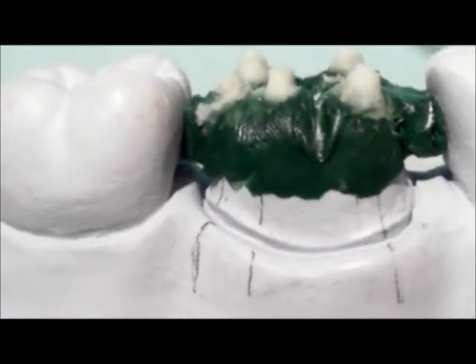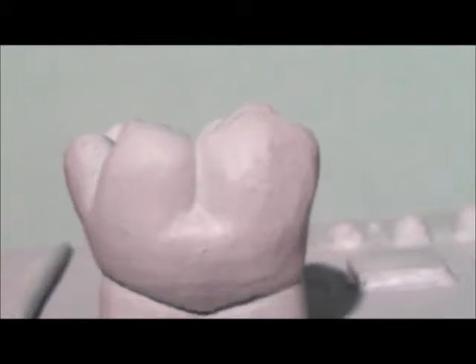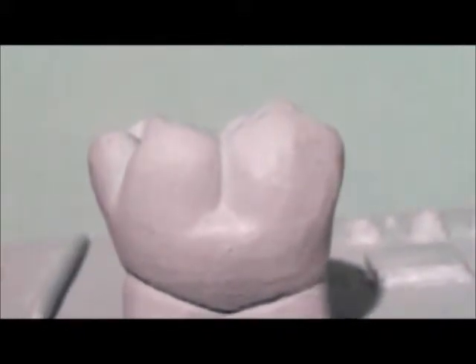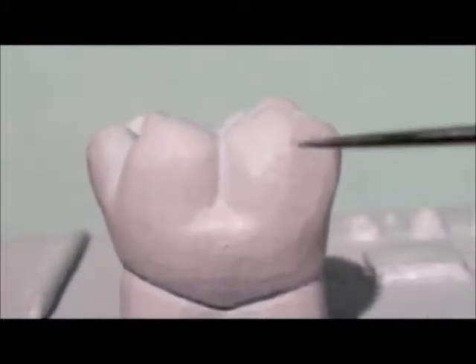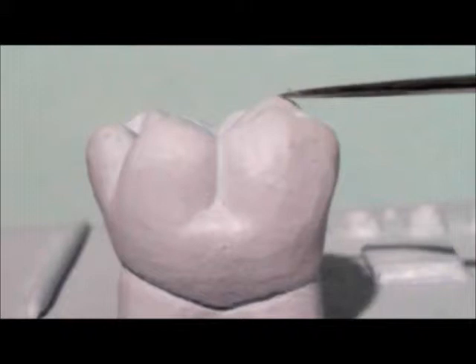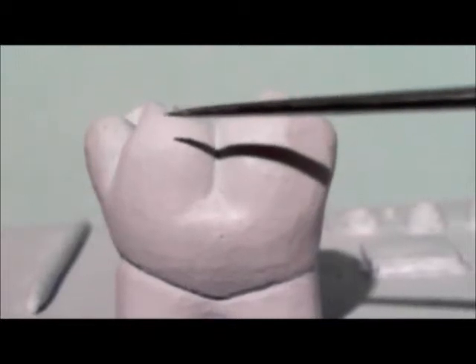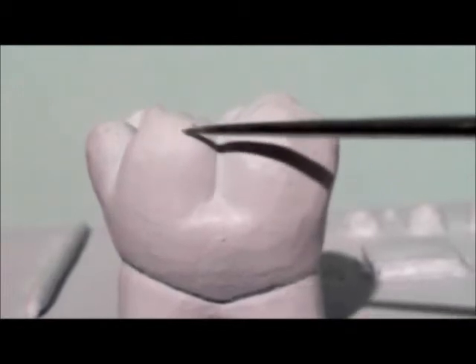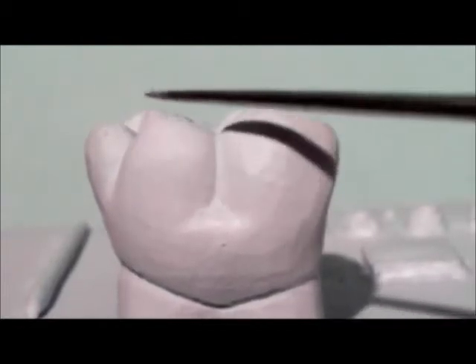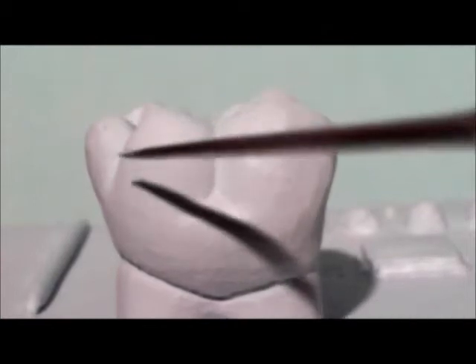Now I'm going to shift gears to the molar that we're working on, and the cones have to represent the cusp tips that we're working with. If you notice, we have the mesial buccal and we have the distal lingual, and we also have the distal buccal cusp and the distal cusp. You notice the distal buccal cusp and the distal cusp, and in the background you see the distal lingual cusp peeking between the two.